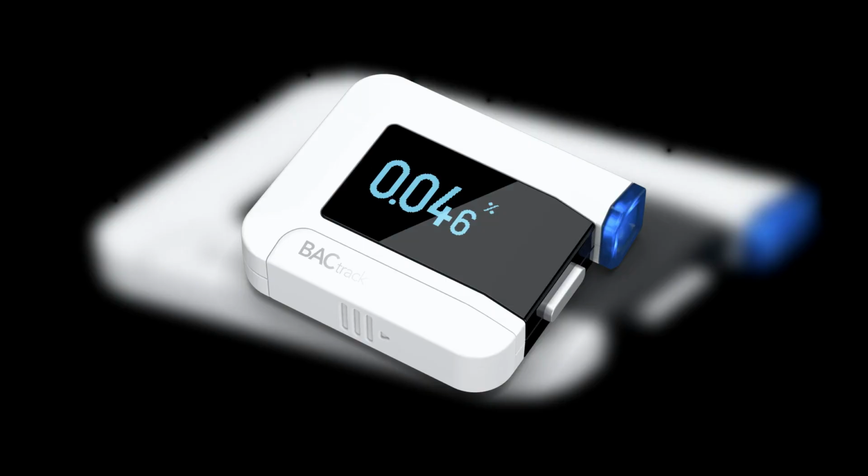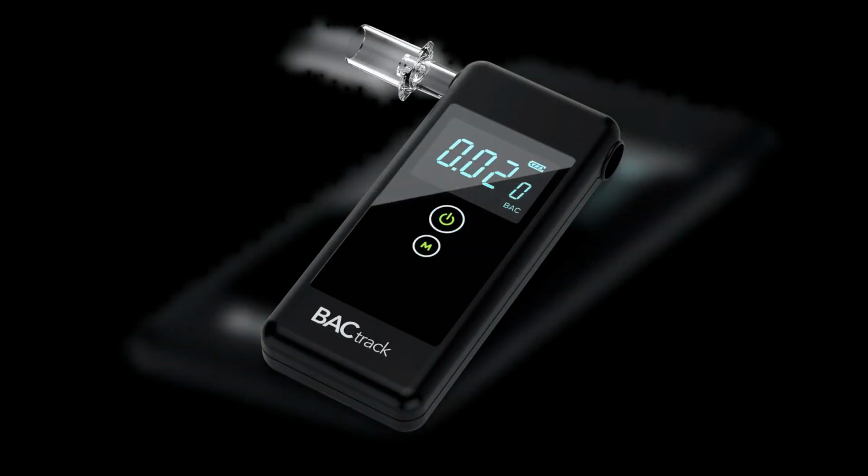It is forbidden to breathe tobacco smoke on the sensor, which can cause a violation of its sensitivity. Do not wash the device with alcohol-containing products. The device must be fully charged. Before testing, the oral cavity is rinsed with ordinary water, which is necessary to avoid saliva and food residues getting on the sensor. Take a deep breath before exhaling. The volume of exhaled air should be at least 1 liter.